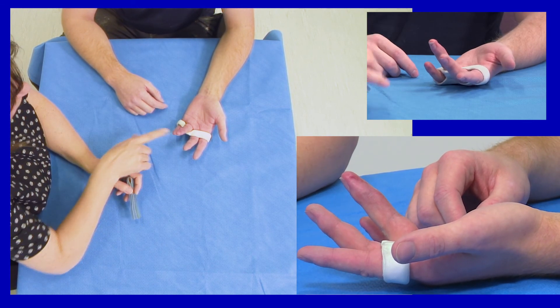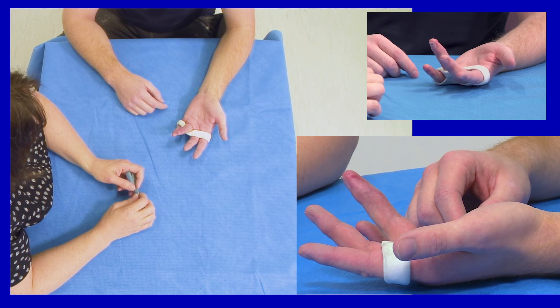And did you find that you caught this finger on things? No, not at all. It was all right? Yeah, it was fantastic.